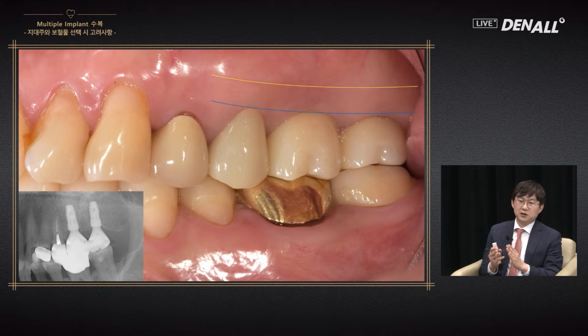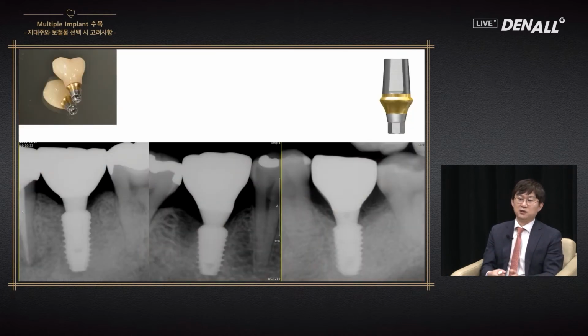In this case, the implant profile will emerge thin and the profile will start 1 or 2 millimeters subgingiva. The profile will be made with the crown. So numbers 1 and 3 are using 4.5 millimeter diameter, and the middle one 5.0 millimeter diameter.